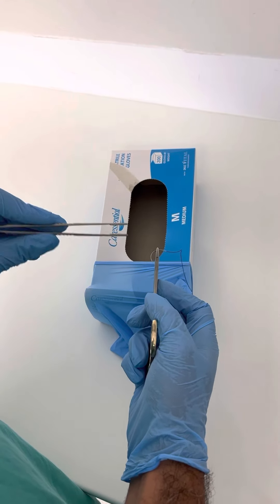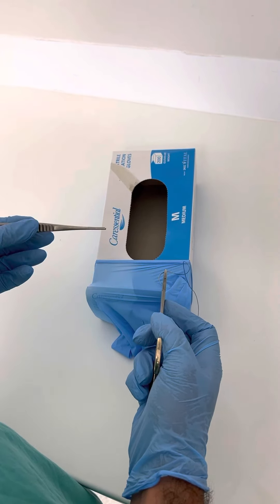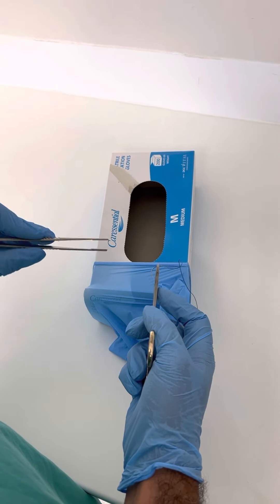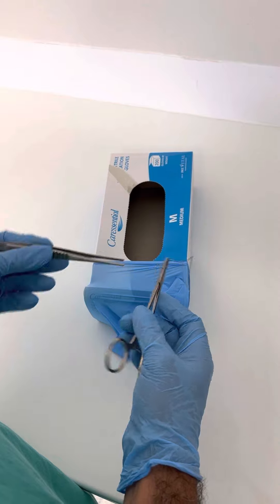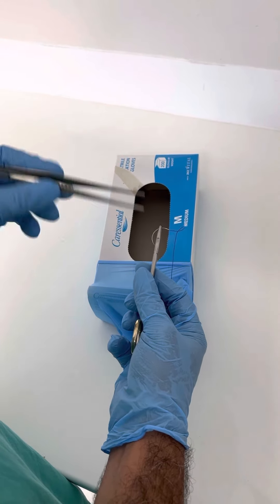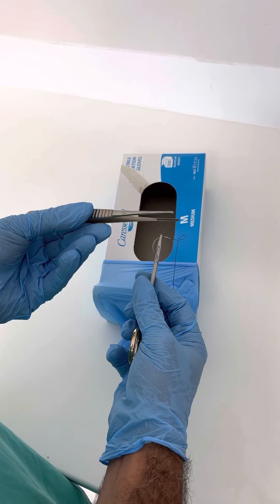The next thing we're going to do is learn how to do square knots. I've got a needle holder in my right hand, a needle, and a pair of forceps.